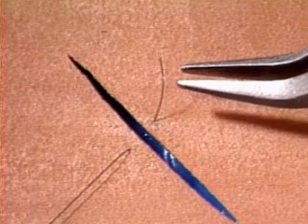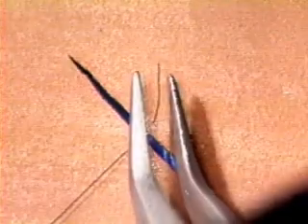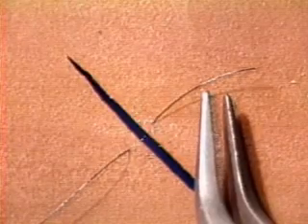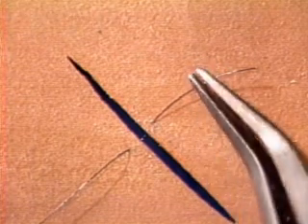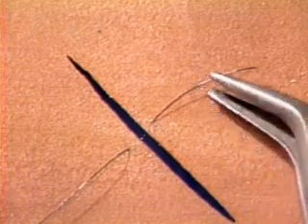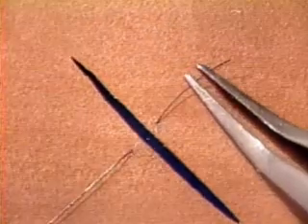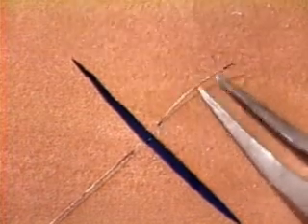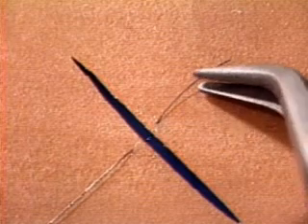If the thread is sticking up in the air, there's no problem. You can get hold of it readily, no matter what direction your forceps are pointing in. But if the thread is lying down, you can only pick it up if the gap between the tips of your forceps is in about the same plane as the thread. If the plane of your forceps is at right angles to the line of the thread, there's no way you can get hold of it until you turn your forceps around.